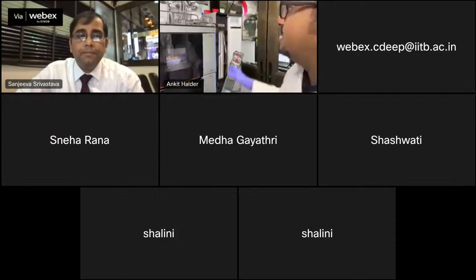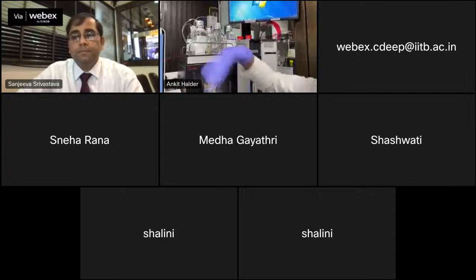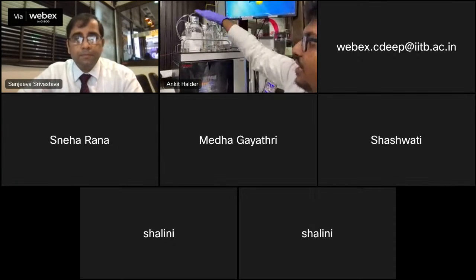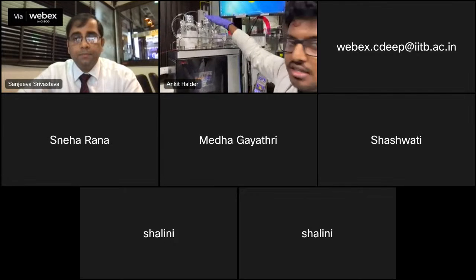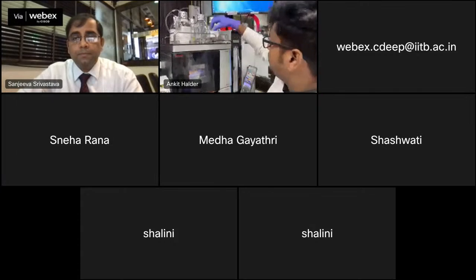So as you can see, these are the two binary systems. As this is the UHPLC, obviously the solvent requirement will be pretty high. This is solvent A, solvent B. Solvent A is mostly 0.1% formic acid, and solvent B is methanol. So this is a binary solvent system.